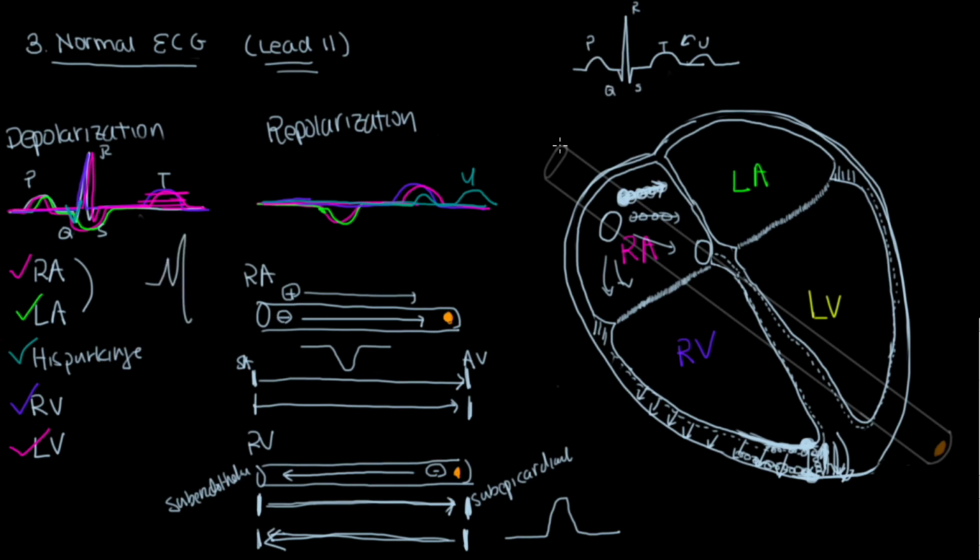One other thing that we didn't account for is the repolarization of the atria and how that fits into the overall picture here. So what can be seen sometimes, which is totally normal, is when you have this P wave, and then you have a little bit of scoop, and then the Q wave moving up to an R, S up, and then another scoop, and then a T wave like this.